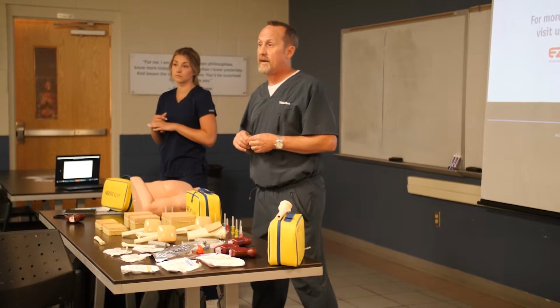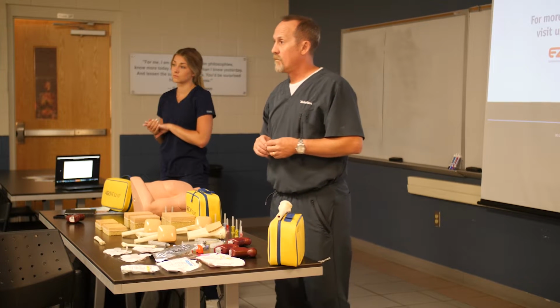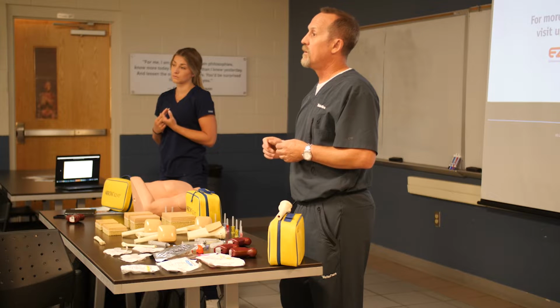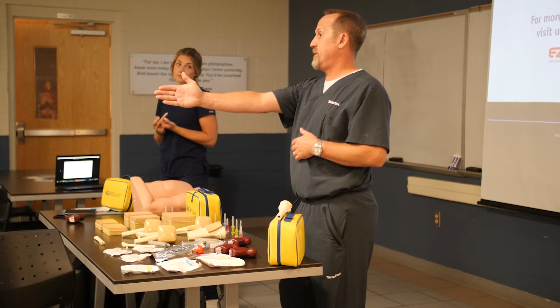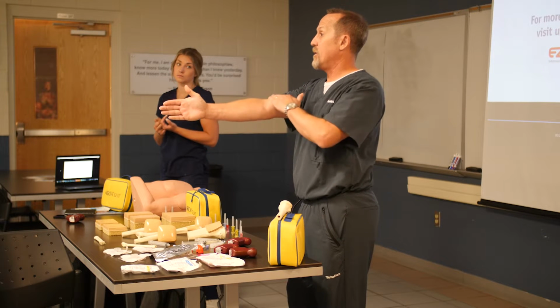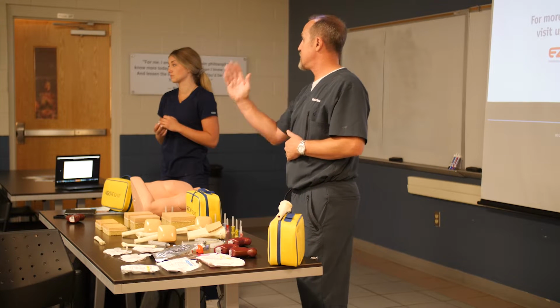Any other questions on that? Because the femur is important: when you line it up, have the foot perpendicular to make sure you get the right landmark. Typically, you want to have the leg in full extension and try to keep it perpendicular when you're landmarking it. So toes towards the ceiling? Toes to the ceiling.